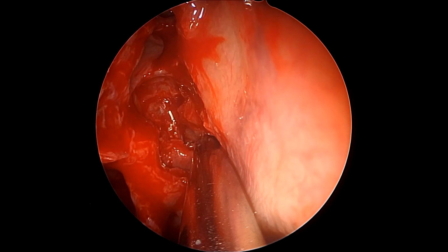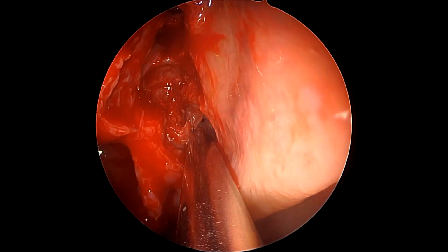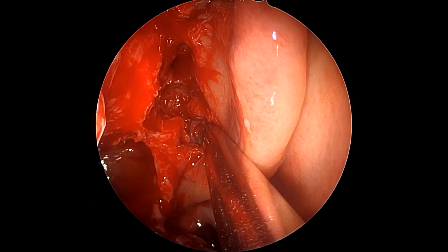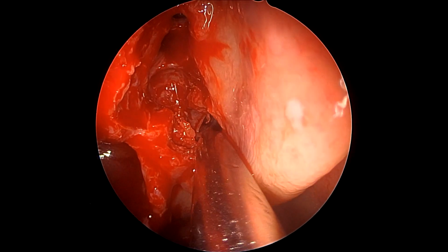So whenever in a revision sinus surgery there is loss of landmarks, one can always follow the horizontal antrostomy ridge and the medial orbital floor to guide us towards the approximate level of the sphenoid ostium and where to puncture it, in case we are not able to negotiate it using our instruments.